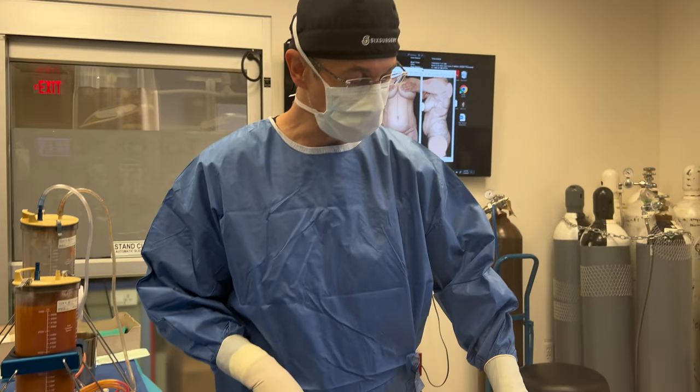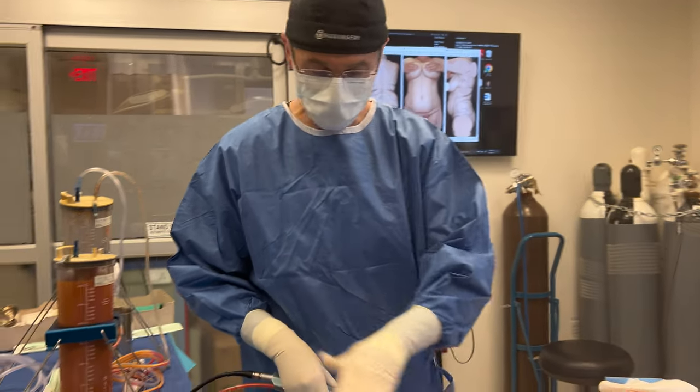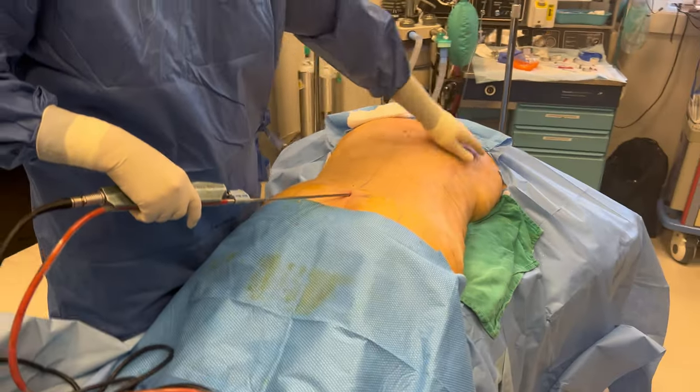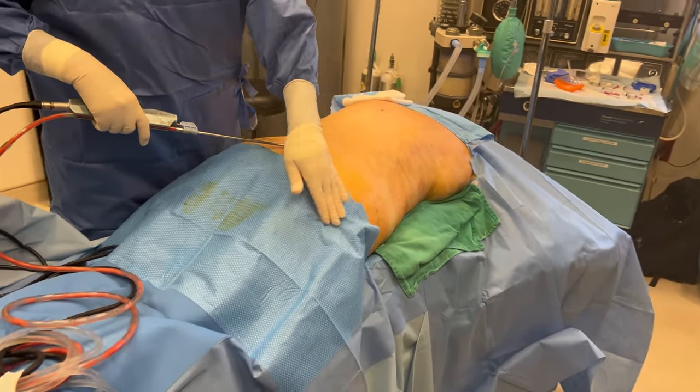We put the patient prone — we're doing some more liposuction on her back. Head is over there and legs are this way, the butt's covered up here. We're going to scoop out more of the love handles, do a little bit more on her flanks, and then start injecting into the butt.